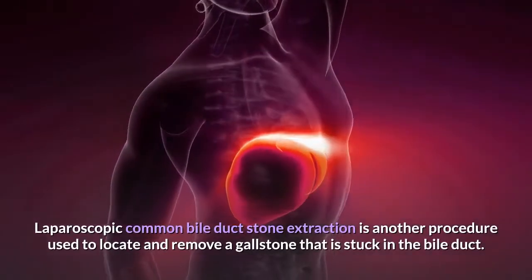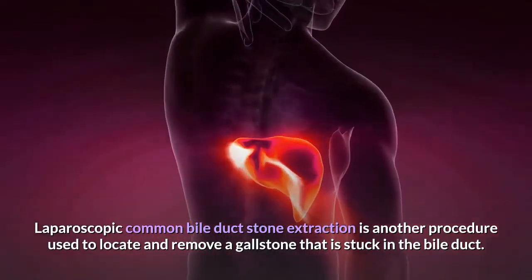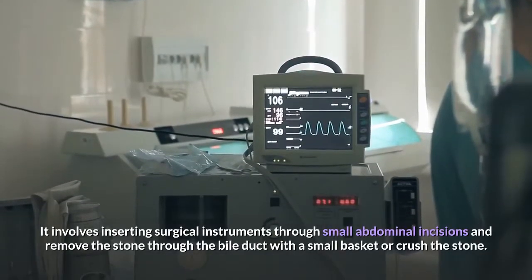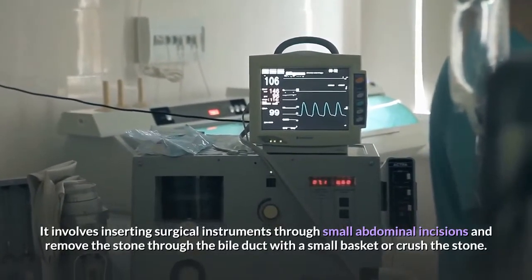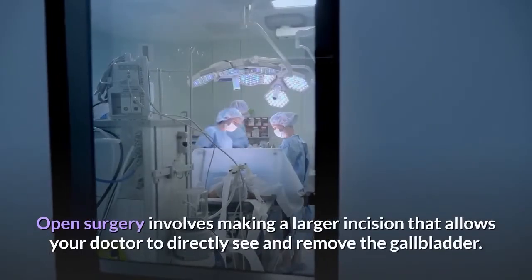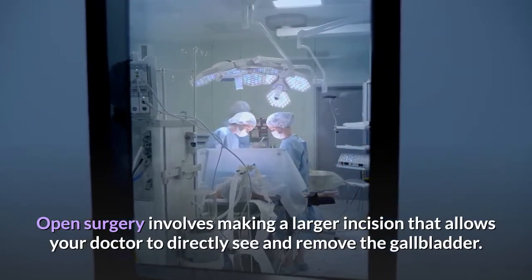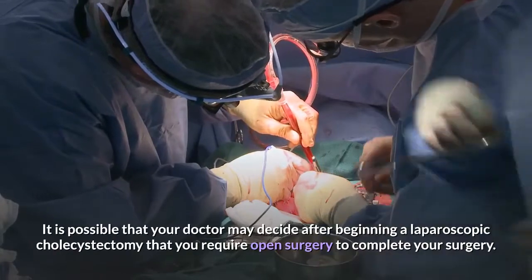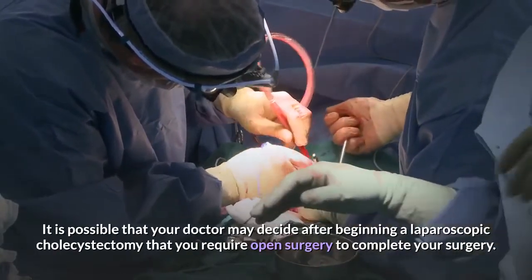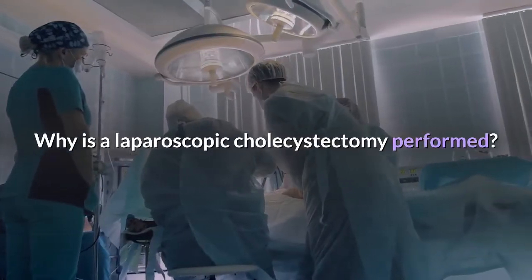Laparoscopic common bile duct stone extraction is another procedure used to locate and remove a gallstone that is stuck in the bile duct. It involves inserting surgical instruments through small abdominal incisions and removing the stone through the bile duct with a small basket or crushing the stone. Open surgery involves making a larger incision that allows your doctor to directly see and remove the gallbladder. It is possible that your doctor may decide after beginning a laparoscopic cholecystectomy that you require open surgery to complete your surgery.